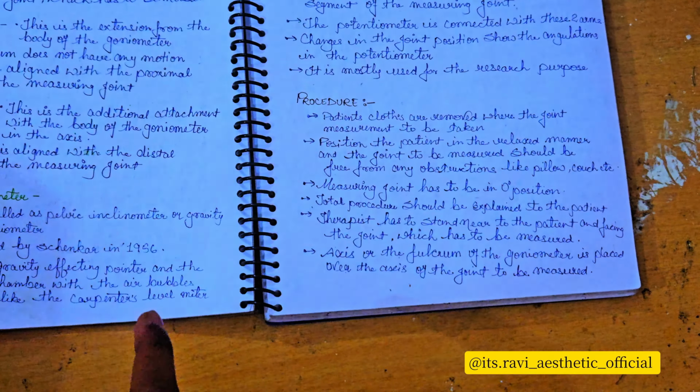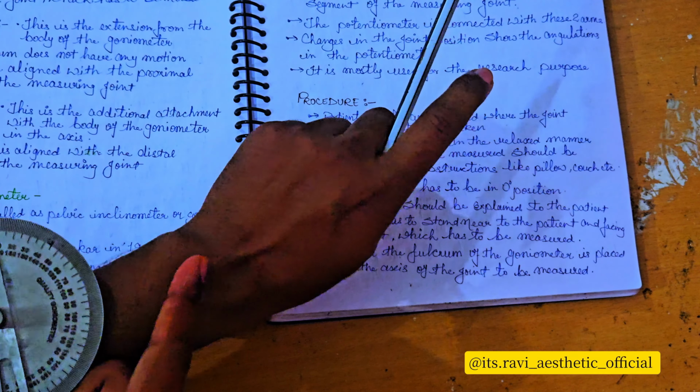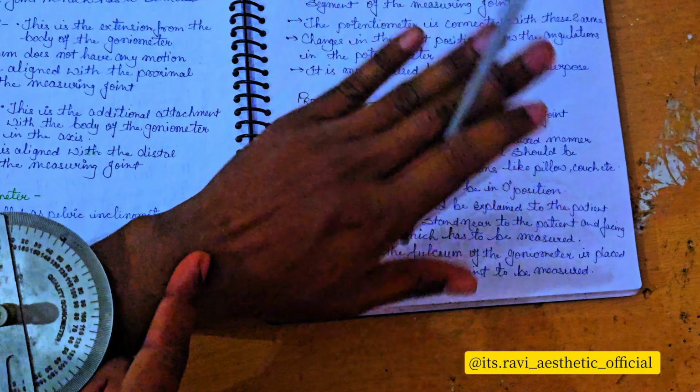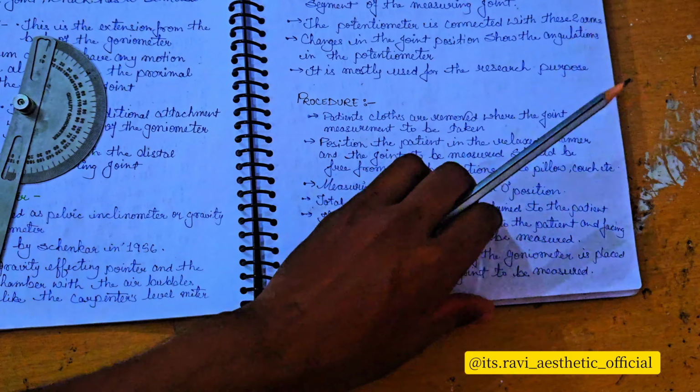This is the axis of the goniometer, and it must lie over the joint axis, for example when you measure the ulnar and radial deviation of the wrist joint.